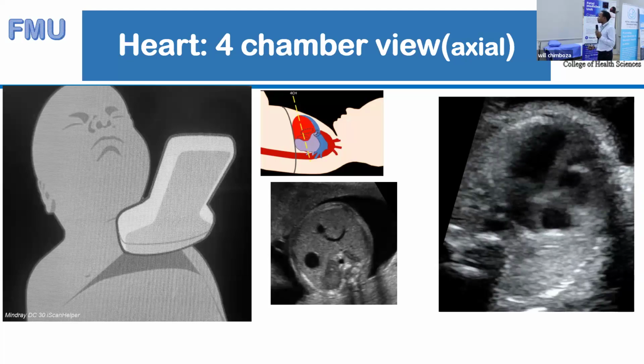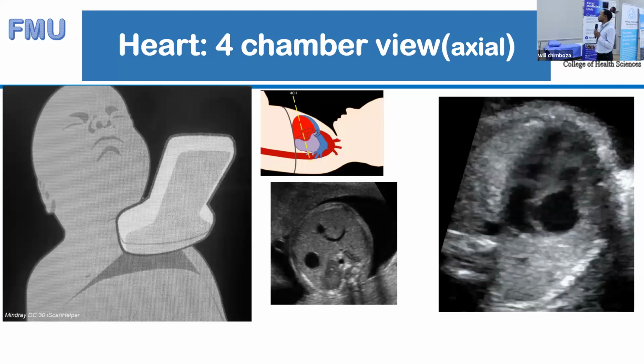There's a foramen ovale that opens into the left. Then we also assess the right ventricle, and there's a moderator band. So the morphologic right ventricle has got a moderator band. And then we also assess the left ventricle, which should be more apex forming. And then when we come to the left atrium, we should see the pulmonary veins entering into the left atrium, and below we can see the aorta, and we shouldn't see any vessels in between.